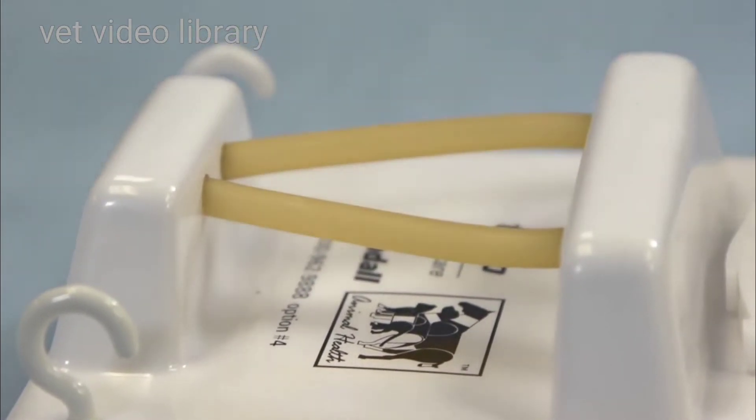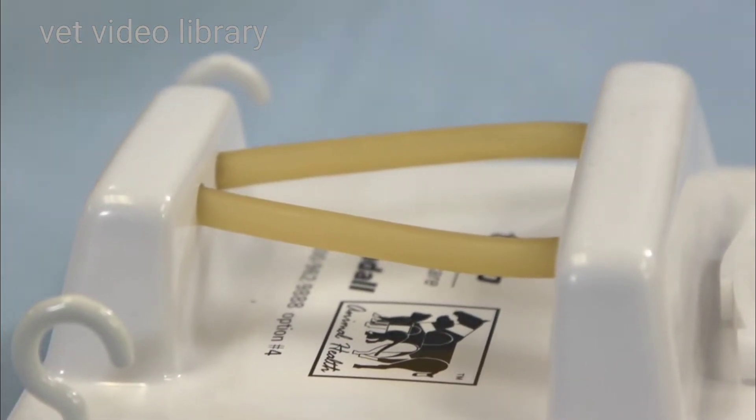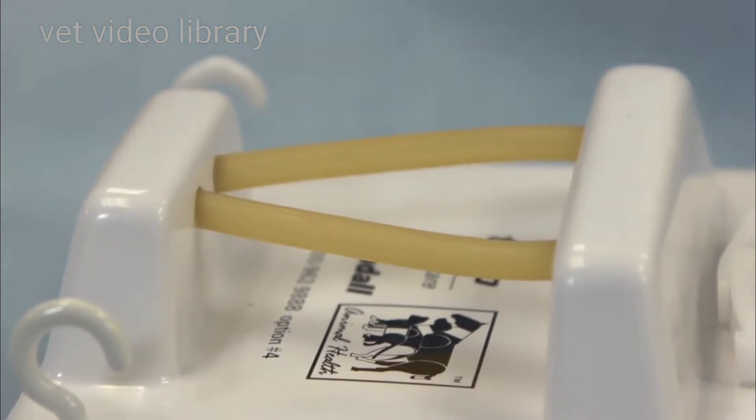And you might encounter this when spaying a dog and ligating the ovarian pedicle that has a lot of fat and a lot of tissue in it.